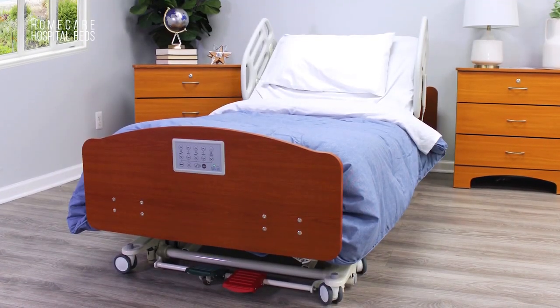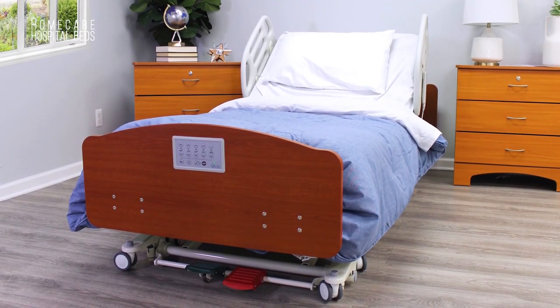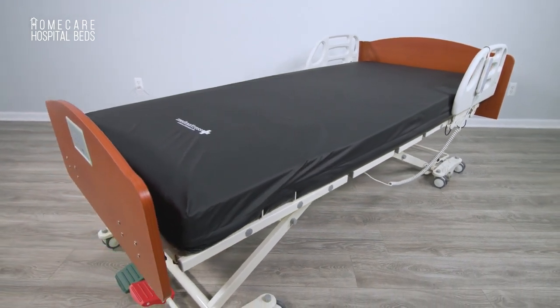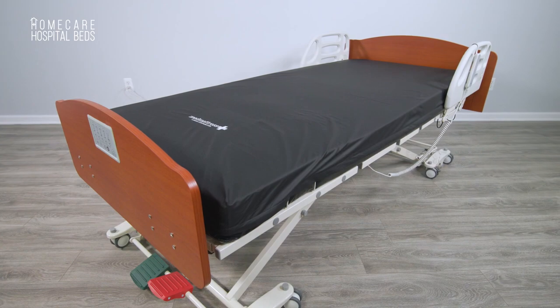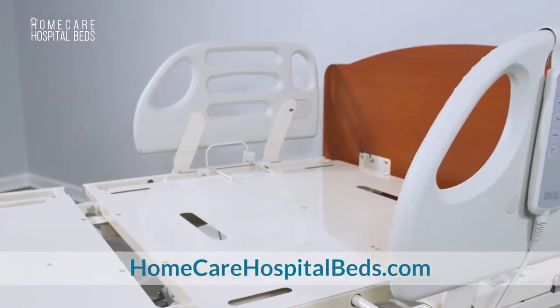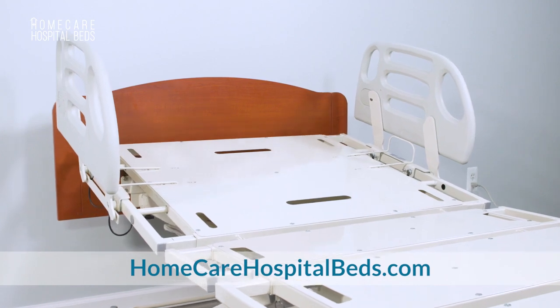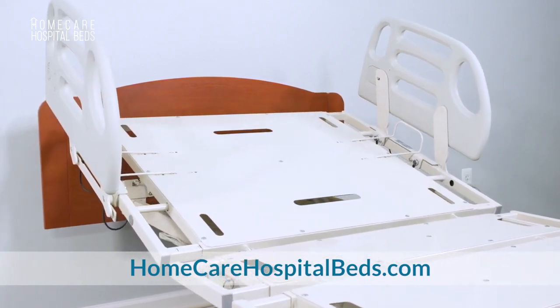Bed assembly is complete and now your mattress can be installed. Thank you for learning about the Home Care Hospital Beds Linicare HC-107 Hi-Low Hospital Bed. You can visit HomeCareHospitalBeds.com to find additional home medical equipment or schedule annual maintenance and repairs.